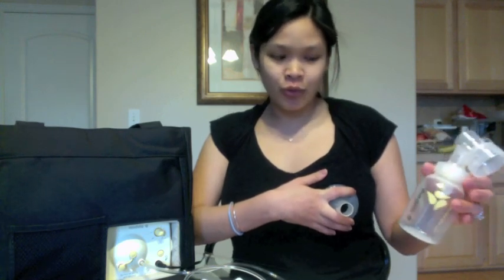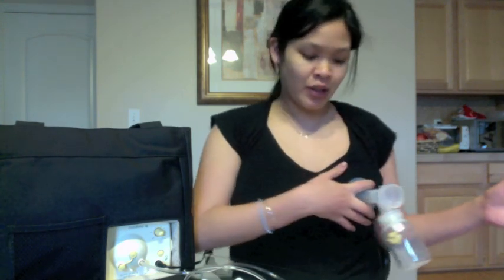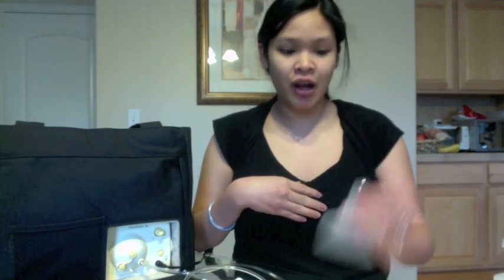One of the tricks that I found, if you are using one of those suction bra thingies, it does hold the shield really, really close in, and it's kind of hard to maneuver back and forth to take it out of the bra. So when you're done, the best thing you can do is just pull off this part and leave your shield in, then you won't risk pulling everything off and everything spilling everywhere. So if you are using one of those bras that keep the breast pumping, just go ahead and pull the top off, set it down, and then go ahead and maneuver this thing out of your bra. The first time I did it, I tried to pull this whole thing off and I spilled some milk. It was a sad day.